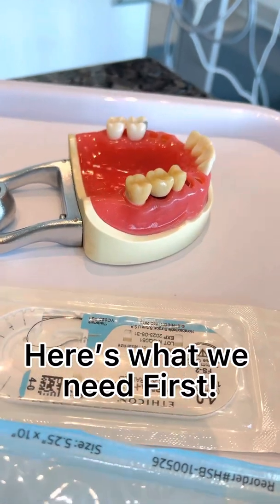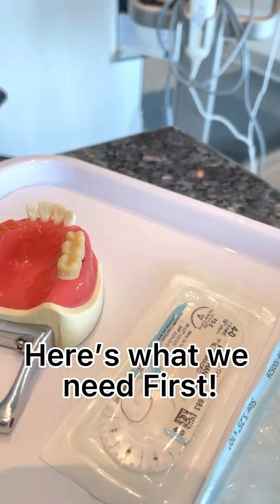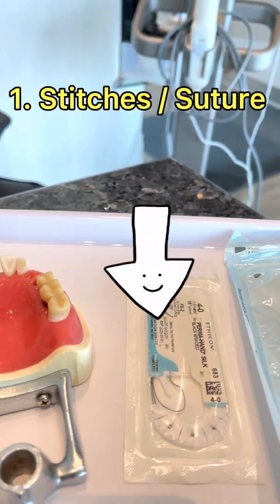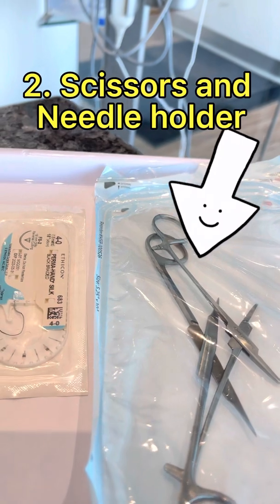Here's what we need first: 1. Stitches suture, 2. Scissors and needle holder.